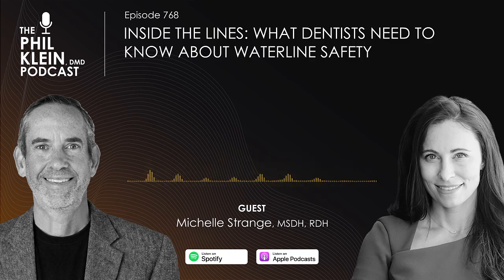To be on the safe side, if you're using a cartridge straw system from Stericyl, it's advisable to buy the shock system that is compatible with that cartridge, because you need the straw to pull the shock into your dental unit, right? Yes, exactly. You have to have that material go through the cartridge and straw. You can't just put a water bottle in there with tubing there for the shock.